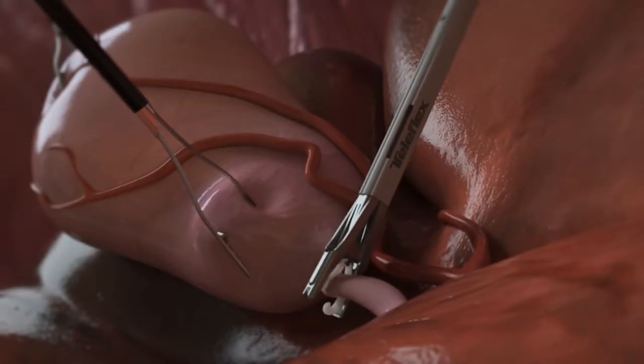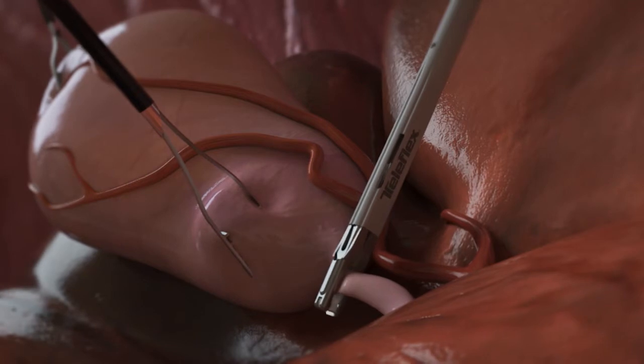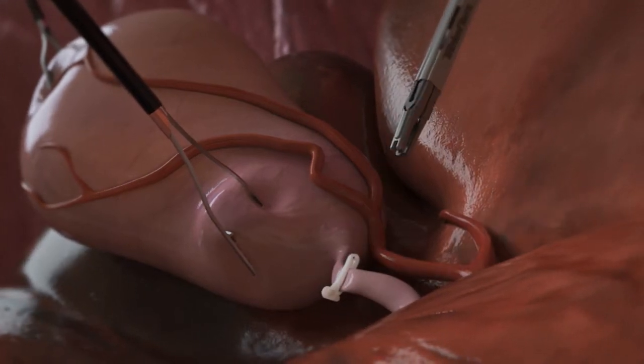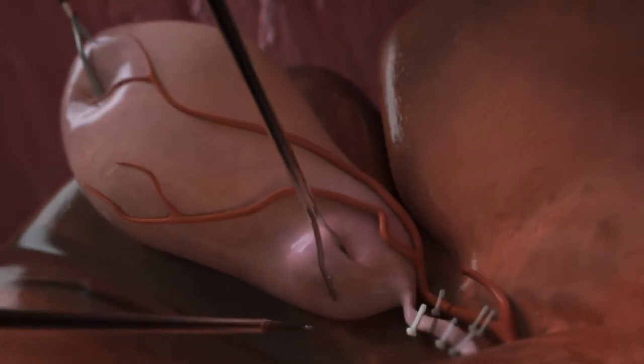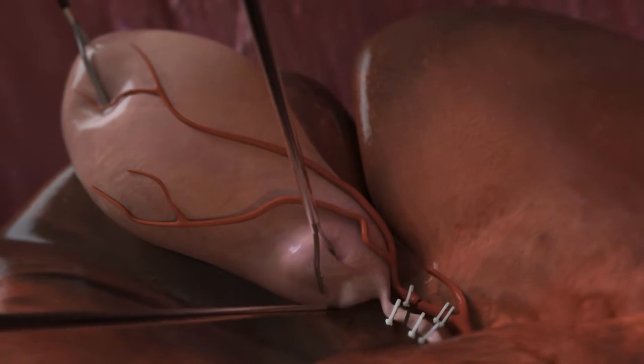5 mm laparoscopic devices such as the WEK Auto Endo 5 ligating clip applier are introduced through a traditional laparoscopic access port.